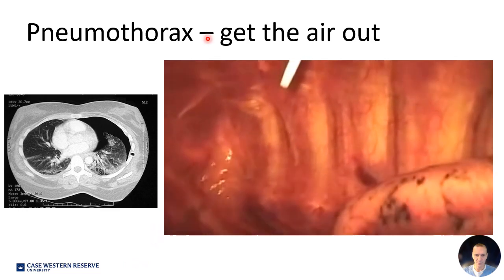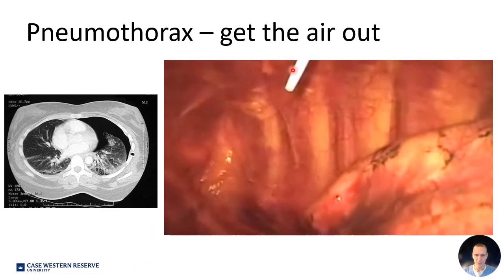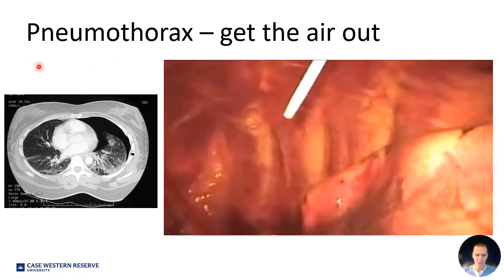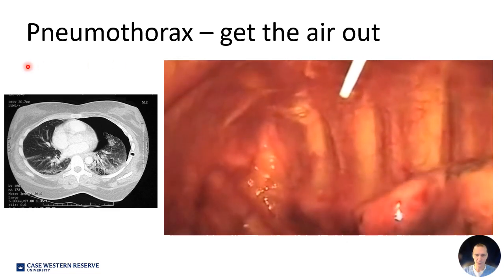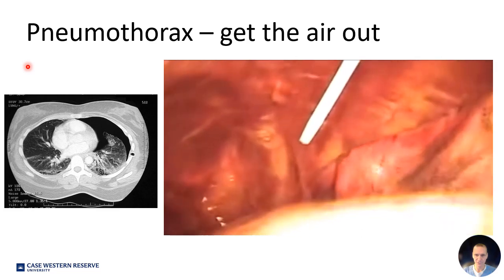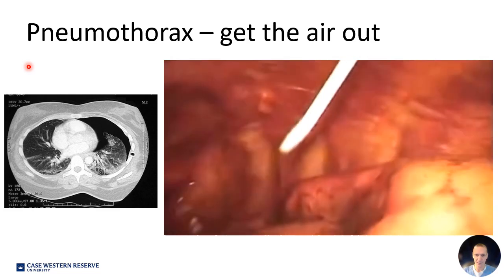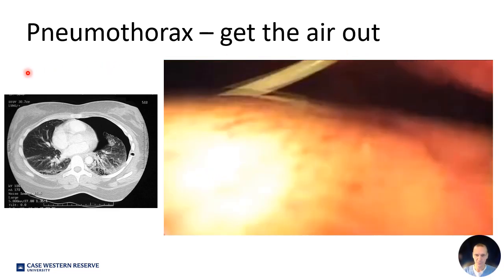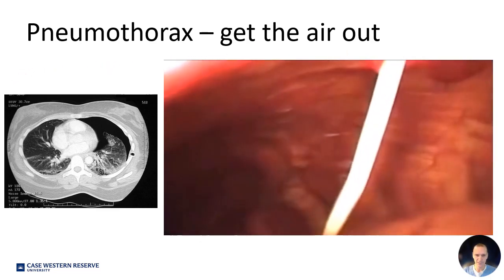Notice the delay with this. I don't know the size of the angiocath. There is a delay, it's taken a while for the lung to re-expand, and this is a discussion for another day, but a chest tube would evacuate that pneumothorax much faster.